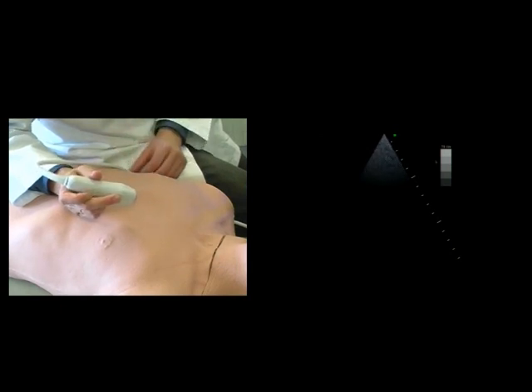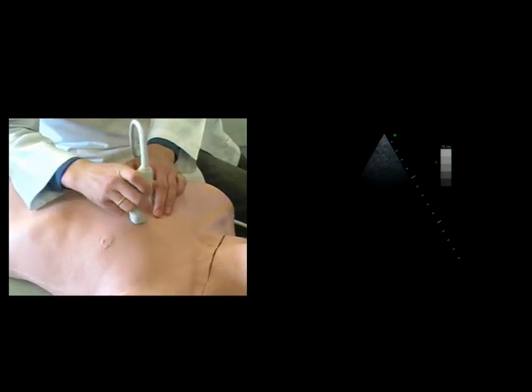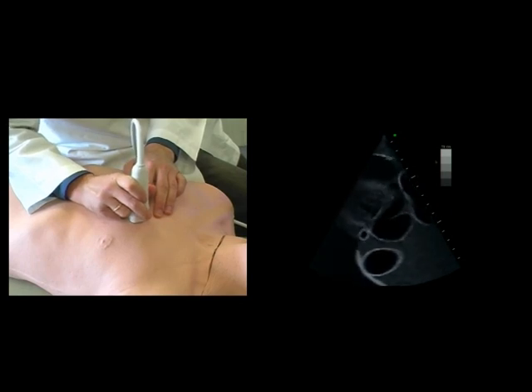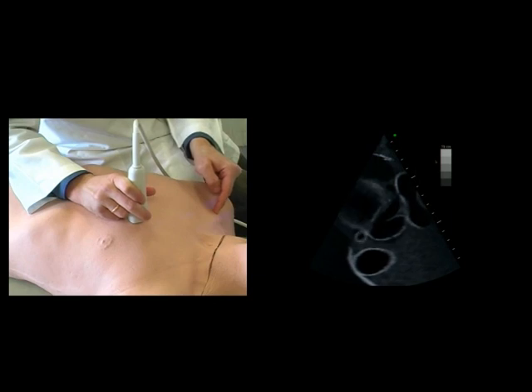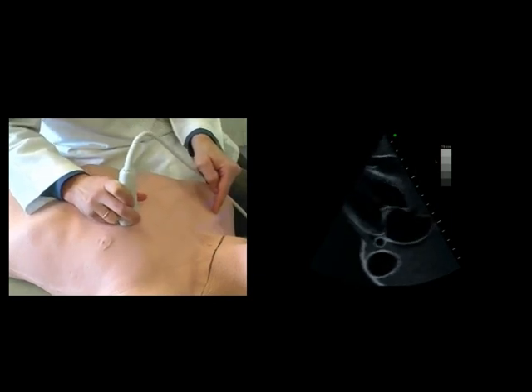The first view we'll demonstrate is the parasternal long axis view. Place the probe approximately in the 3rd or 4th intercostal space, just lateral to the sternum. The index mark should be pointed towards the right shoulder of the patient. Maneuver the probe by sliding and tilting until you obtain the appropriate image.